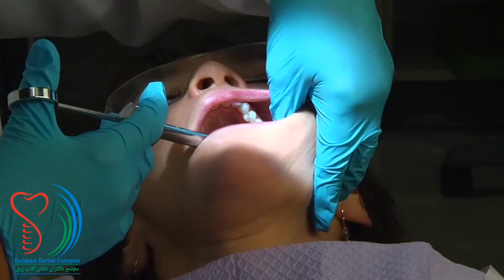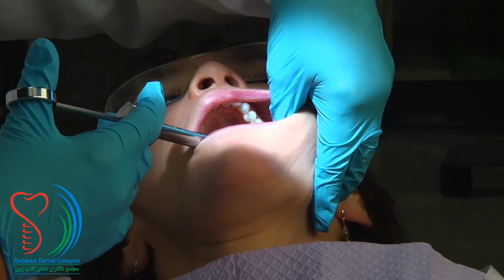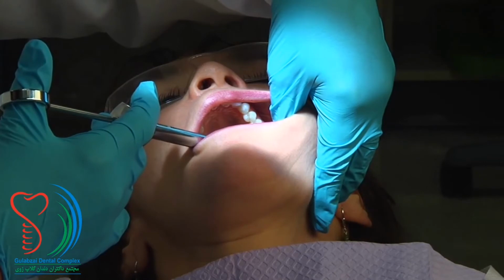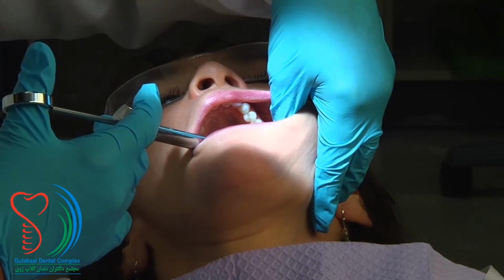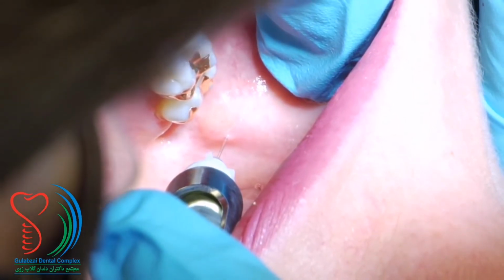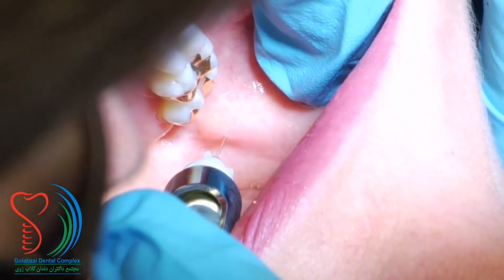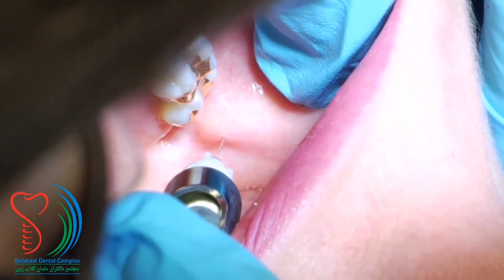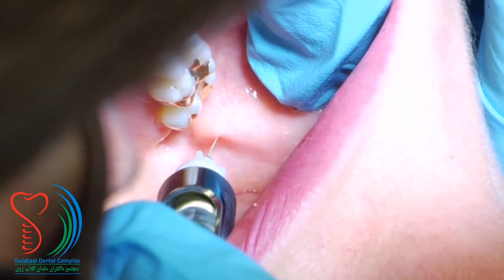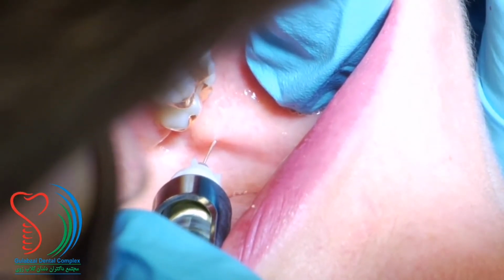When you have completed the IA, you will want to anesthetize the lingual nerve, which is about half the distance of the injection site on this same track. In order to anesthetize the lingual nerve, all you'll do is withdraw the needle about halfway. After a negative aspiration at that point, deposit about 1/8 of a carpule of your anesthetic, and this will then block the lingual nerve.